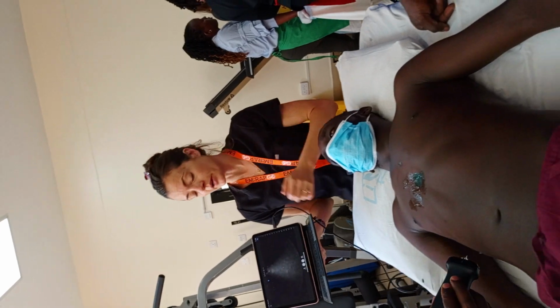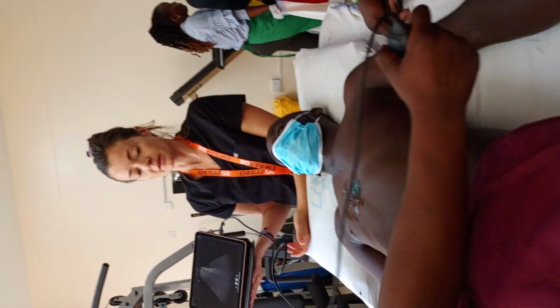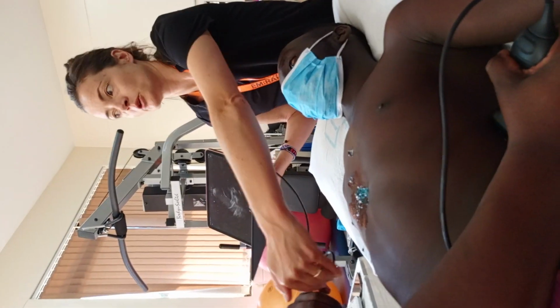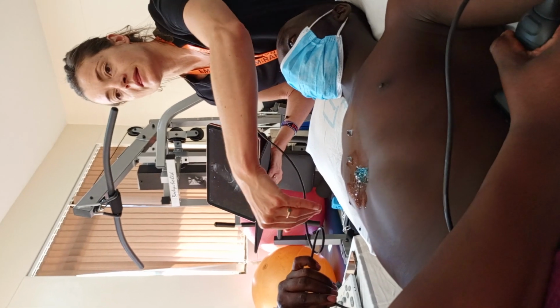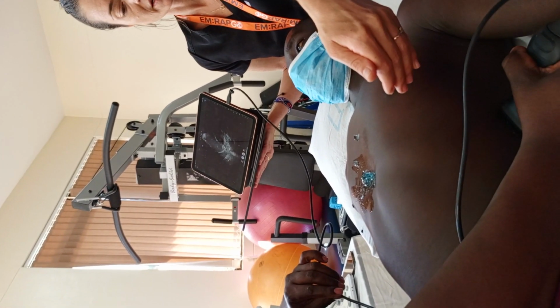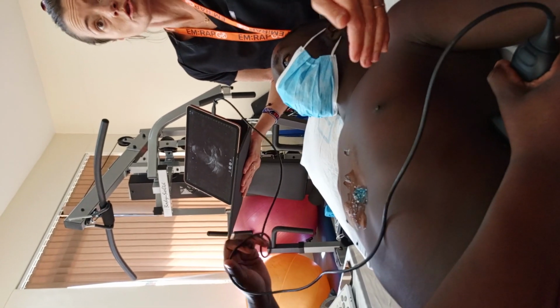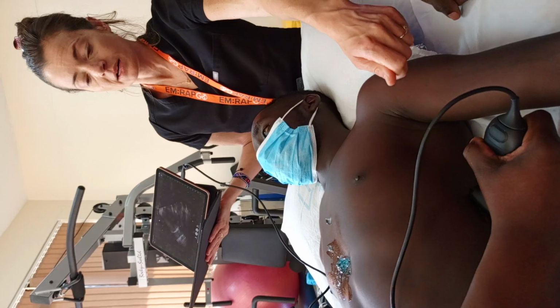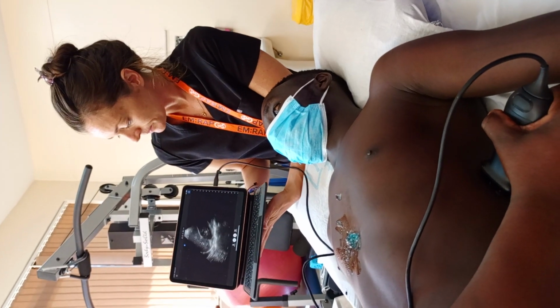Oh, you want to do left upper quadrant? Okay, so we're going to do left upper quadrant just to compare to the other side. So quick thing about the left upper quadrant. On this side, we had liver pushing down on the kidney, so that space is a little bit lower. On this side, we don't have a big liver pushing down on our kidney. So you're going to go a little bit more superior on the patient's body, and it tends to be a bit more posterior. So let's take a look.